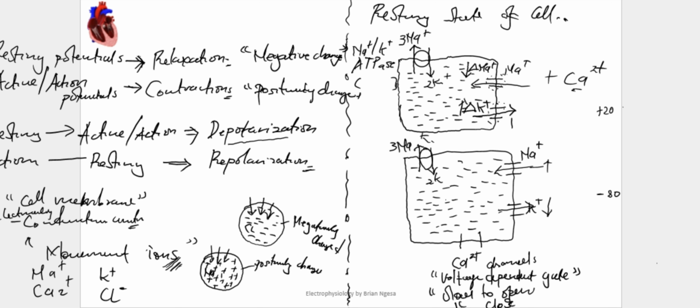So let's put a graph. This is a y-axis representing voltage. Let's choose millivolts, which will be most appropriate. And the x-axis is a representation of time, we can say seconds, though milliseconds will be more appropriate. But just know this is a representation of time.